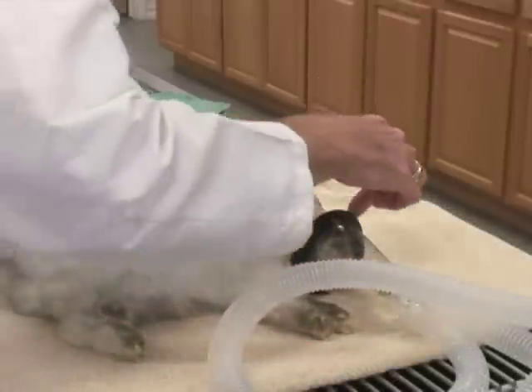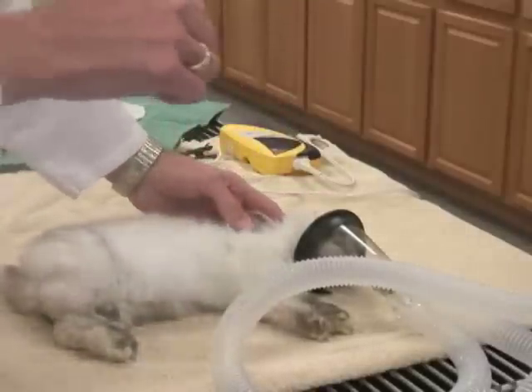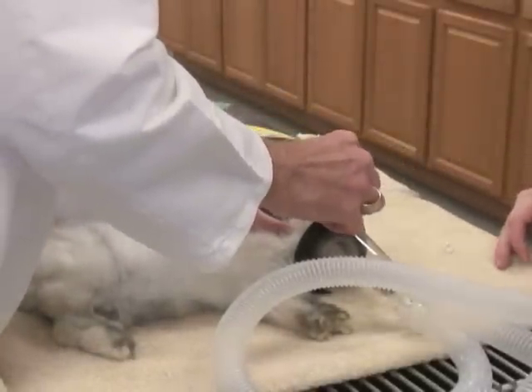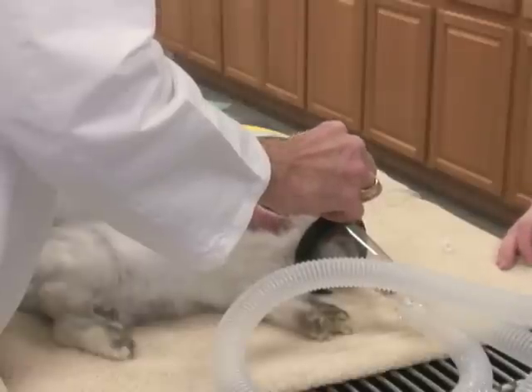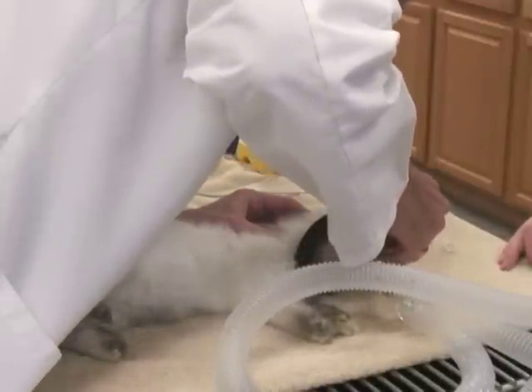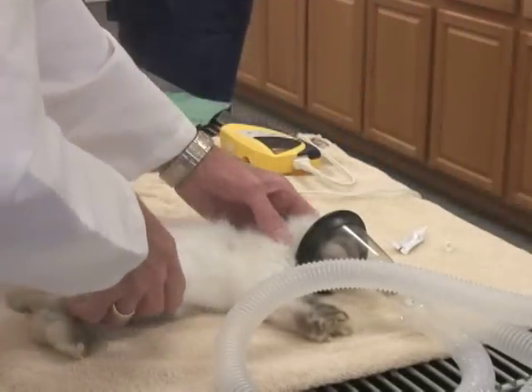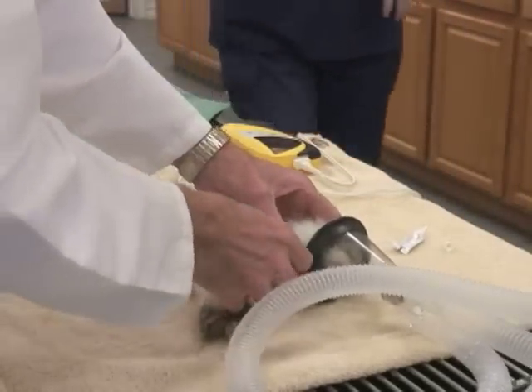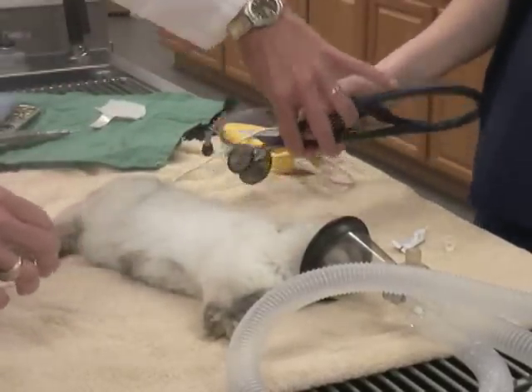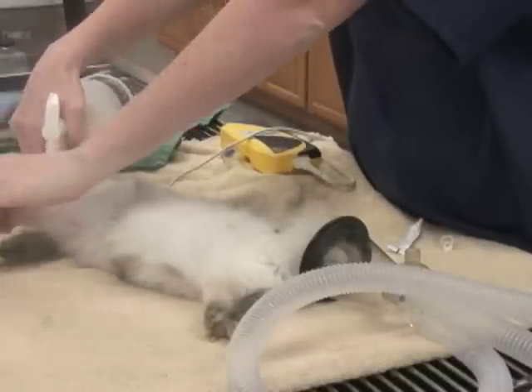We'll just watch her blink reflex — we generally use that to determine when her blink reflex is greatly minimized. We're going to put some lubricant in her eyes. We'll turn her down just a little bit, maybe down to about four, to keep her corneas moist. And we'll switch to that little bitty mask that we put on the nose. This is a pulse oximeter — it measures her heart rate and whether she's oxygenating, getting enough oxygen.